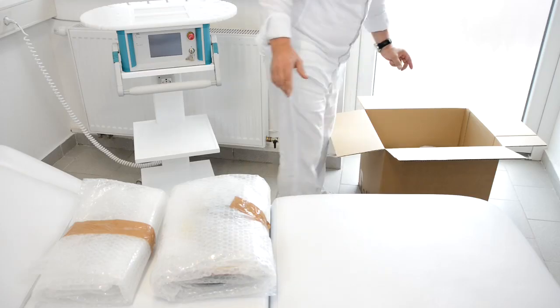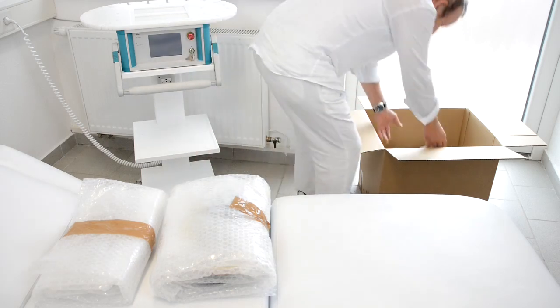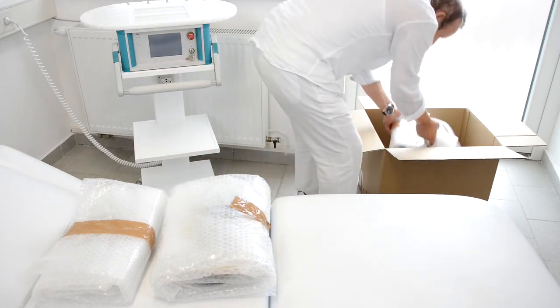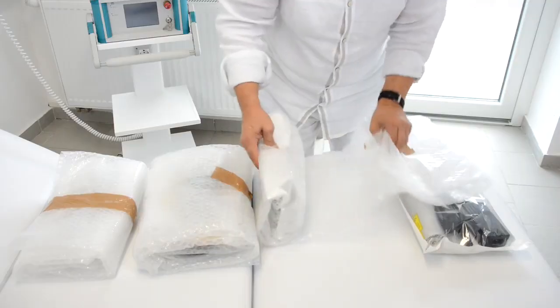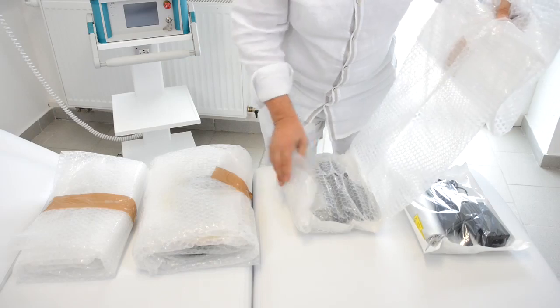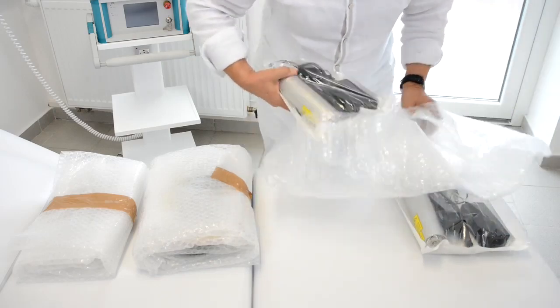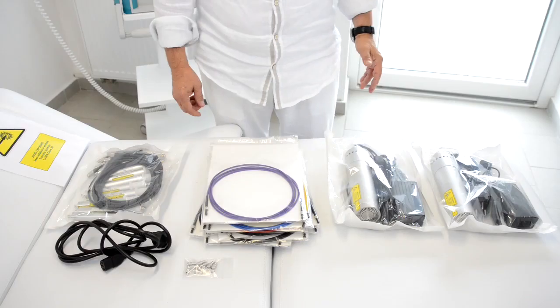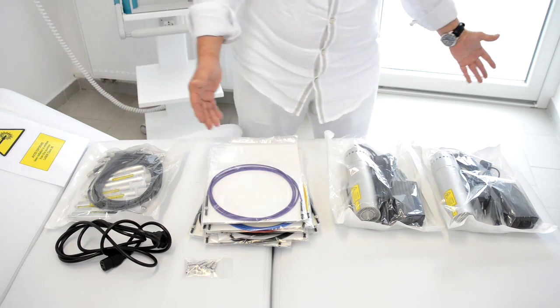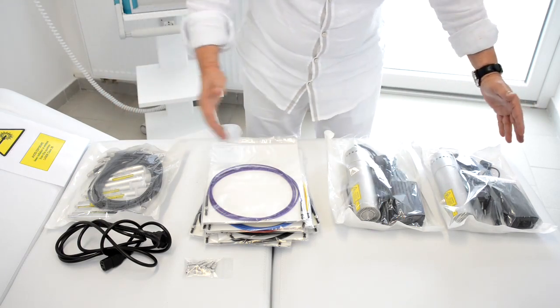So in the next step we take out the laser modules and the different cables and fibers from the package. So now I take out the different laser models from the protecting foil. So now I unpacked everything from the box and you see we have all this equipment here.